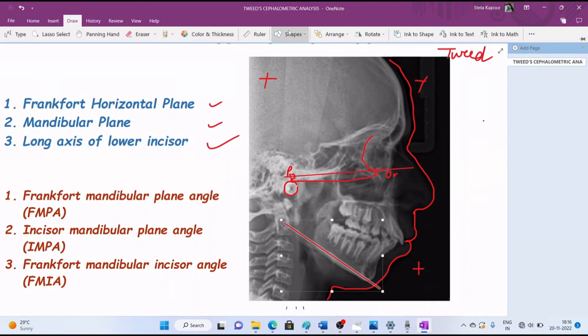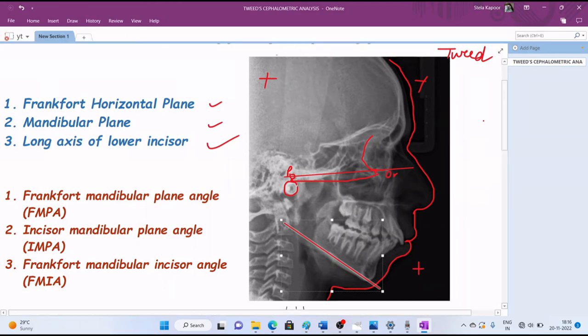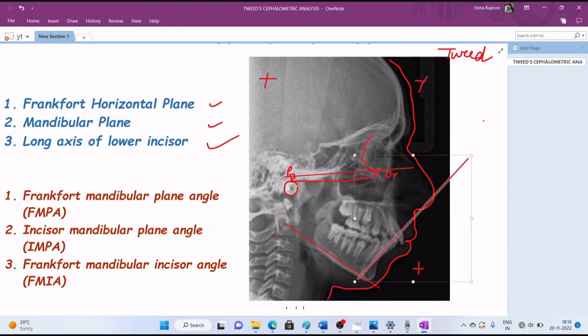Now for the long axis of the lower incisor, it is very easy. We need to draw the lower incisor. You can visualize this is the most proclined incisor I am taking. This is my long axis of the lower incisors, and the incisor I considered is this one, the most proclined lower incisor.